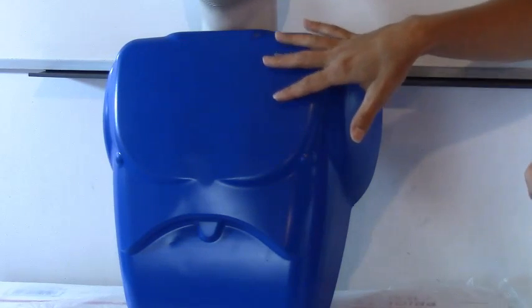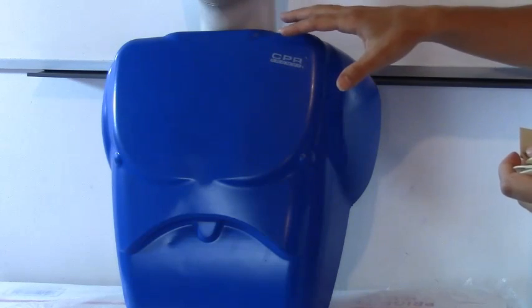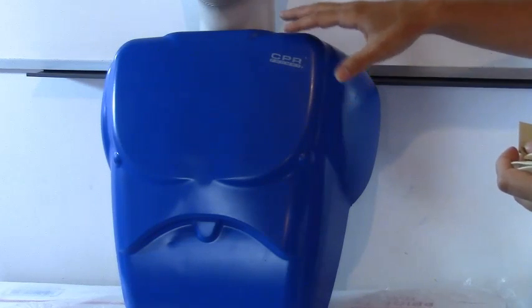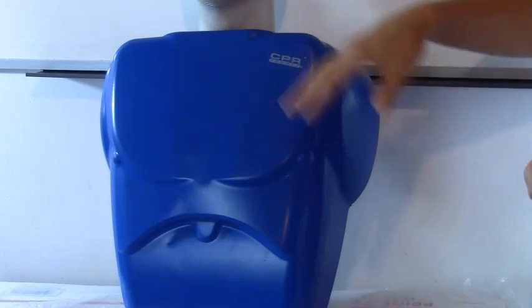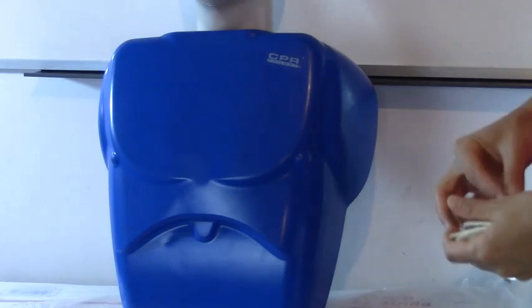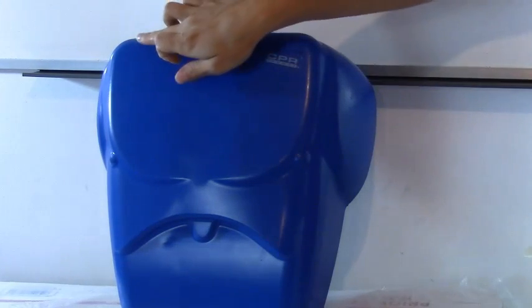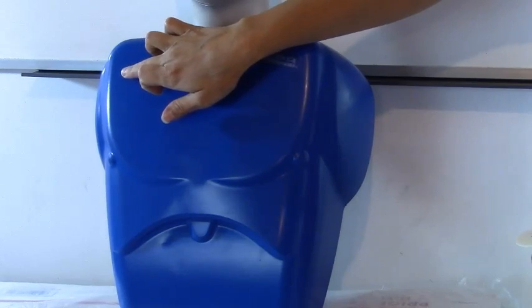So first what we're going to do is we're going to place our arm leads. Now you can use your left right arms and lower legs but you can also use the chest and since this dummy doesn't have any arms or legs we're going to use the chest. So first what we're going to place we're going to place our right arm lead and you're going to find the clavicle and you're just going to go right below the clavicle.